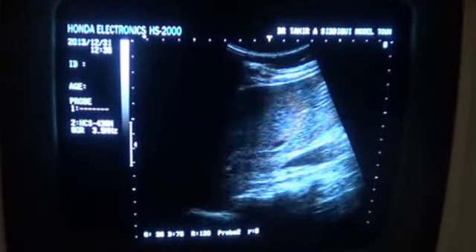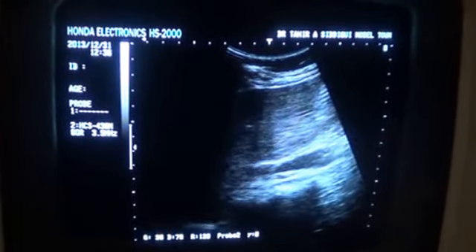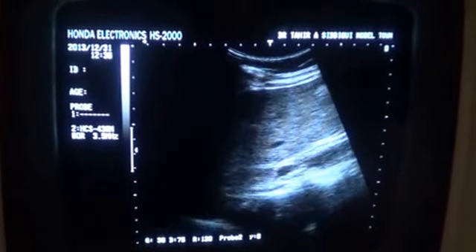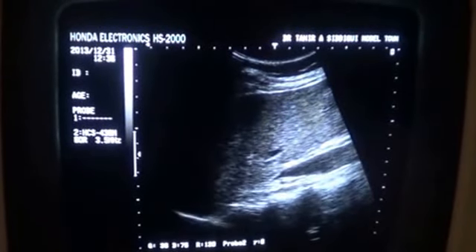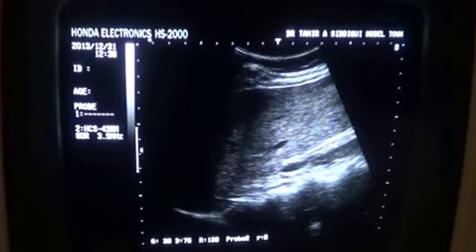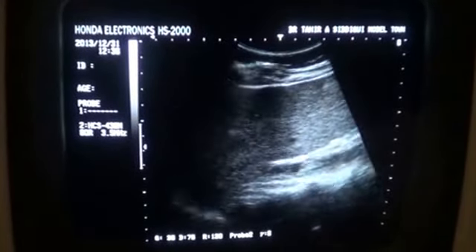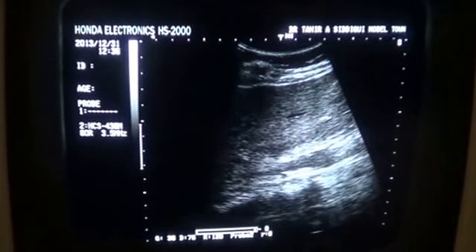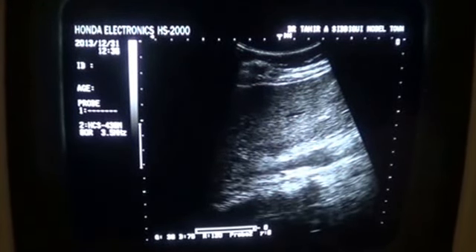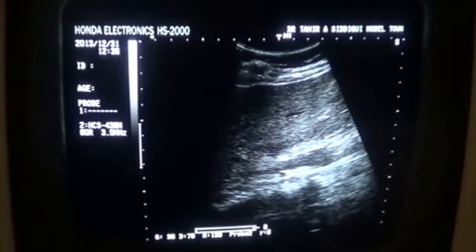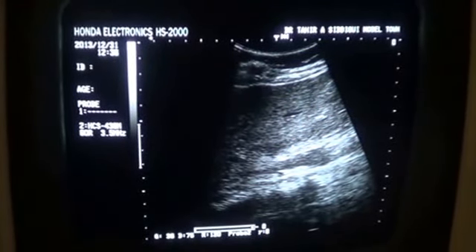This video segment is to study the right renal artery. The patient is presently in left lateral decubitus posture and the probe is at the subcostal region at an angle of about 60 degrees.